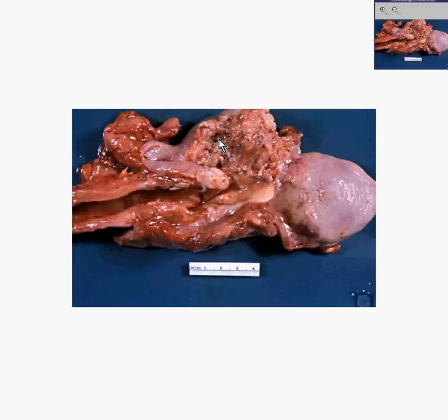You can see some black areas, perhaps old hemorrhage. You could see that it's a very non-homogeneous uncut section. You can also see down here, this appears to be the opened portion of the larynx and trachea as well from posteriorly. I'm guessing that is. Let's take a look at this tumor of the posterior part of the tongue microscopically.